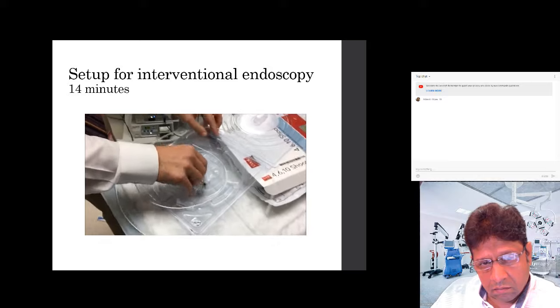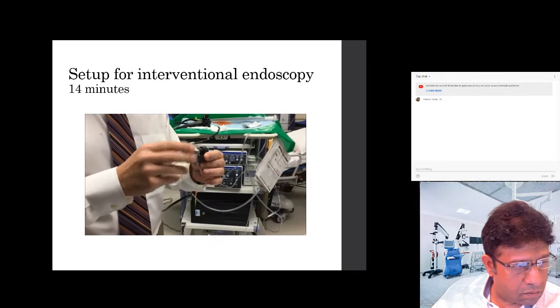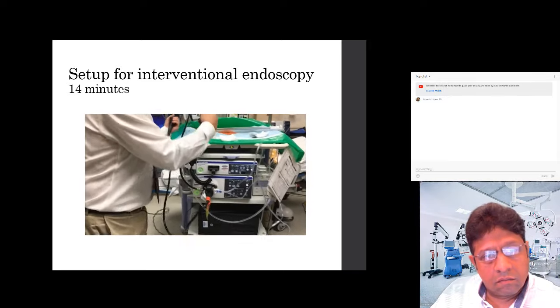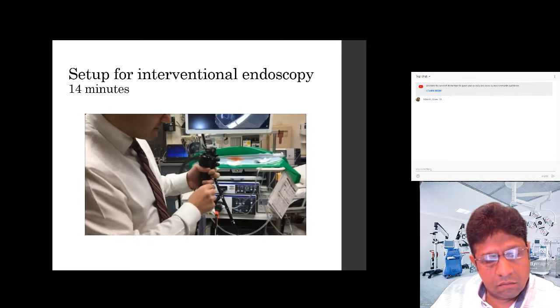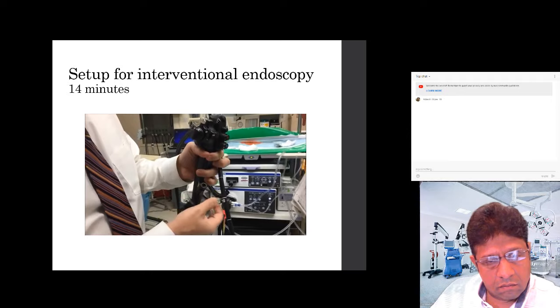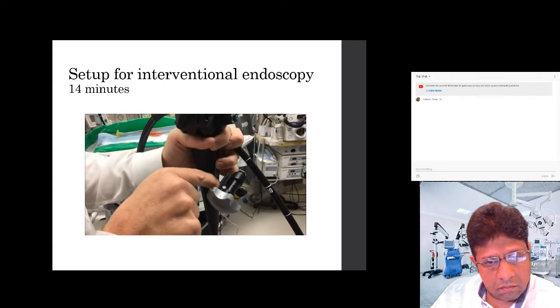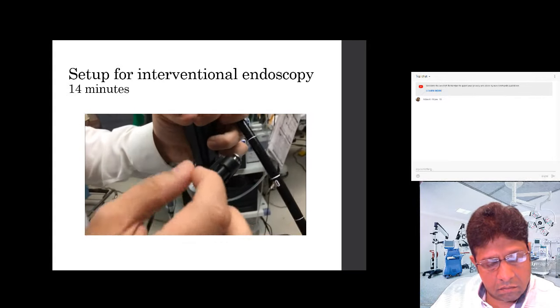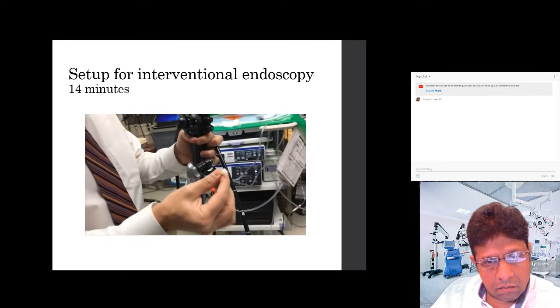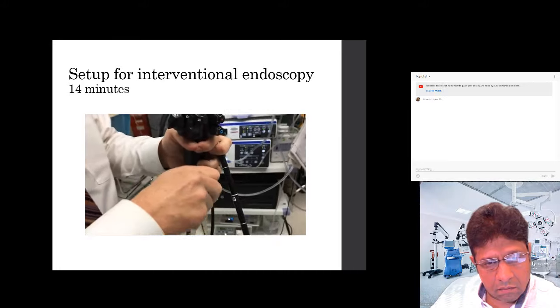Okay. So basically, this is kind of the dial, right? This is how you shoot the bands. And basically what we do is we take the device. This is the channel that we're putting all those little devices through. We open it up and just put this in there. This little diaphragm here is normally not punctured yet, so it's not able to pass anything through. So you take this little pin that comes in the kit and put it through like that until you pop a hole. You just pop it open, take it out.